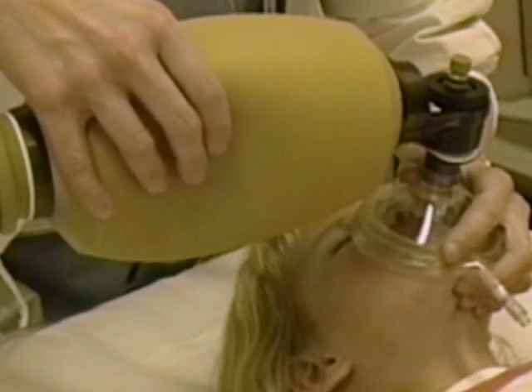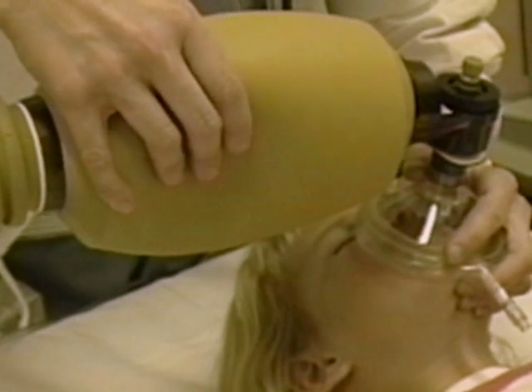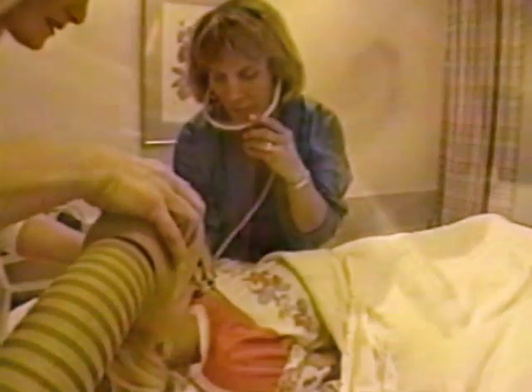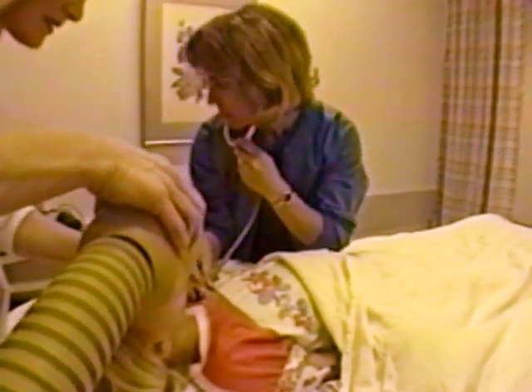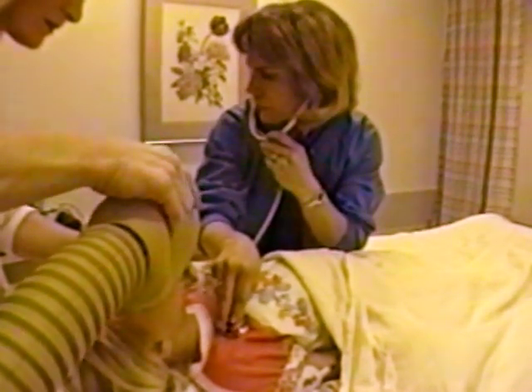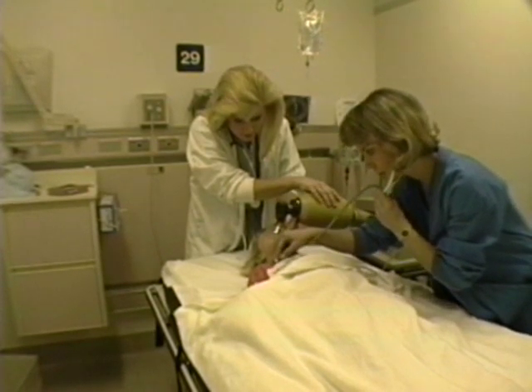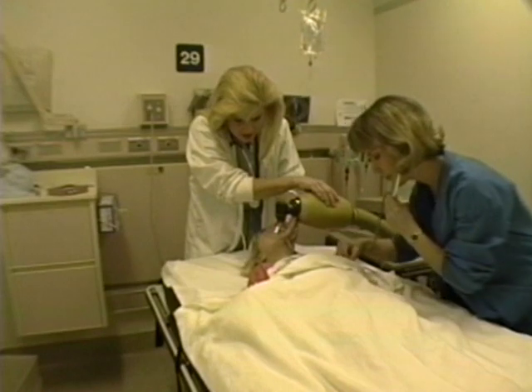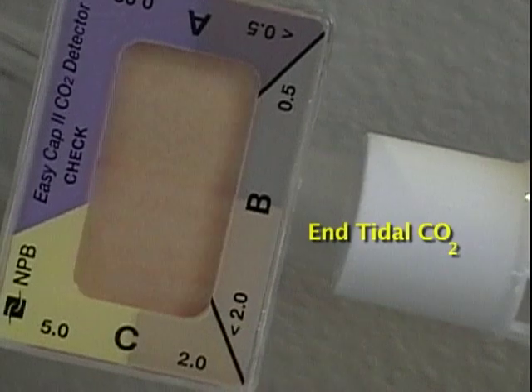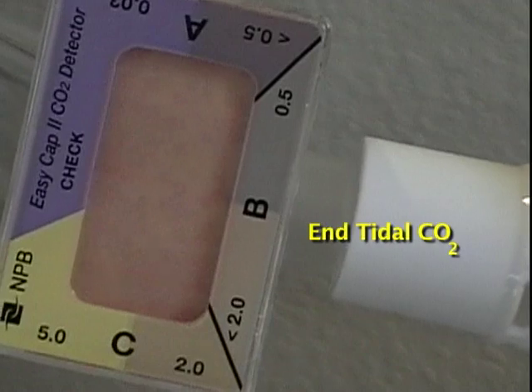Pay attention to the resistance you feel as the lungs inflate. Obstruction makes squeezing the bag more difficult, whereas a leak in the ventilation system makes squeezing the bag very easy. In both these cases, however, the chest won't rise. When in doubt, have a helper listen to the chest as you ventilate. You should hear breath sounds. Although there are some medical conditions where breath sounds are hard to hear, the absence of breath sounds almost always means inadequate ventilation. If an end-tidal CO2 device monitors the patient, you should see evidence of exhaled CO2.